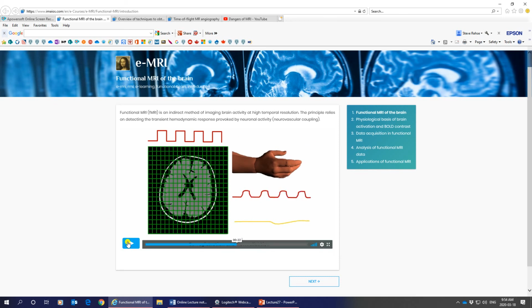The data you could see in that image is really lousy. We're not really good at getting MR signals out of the brain yet. They're very weak. If you just said, can I see what parts of the brain light up, it's much more complicated than that, because the change in signal is really small. What we can do, though, is we know when we were telling the patient to activate and deactivate. Now this could be wiggle your thumb, don't wiggle. Wiggle your toe, don't wiggle.